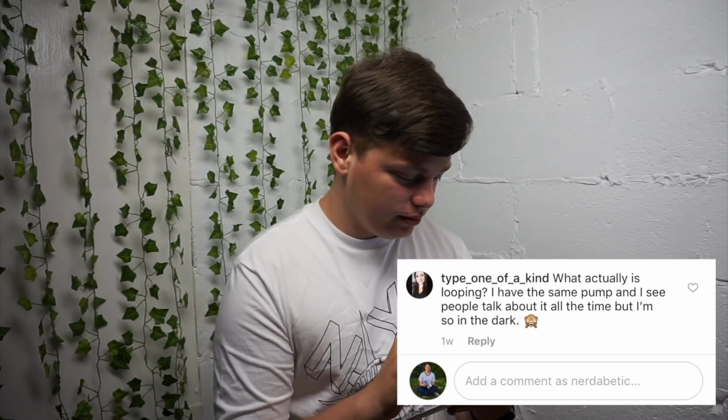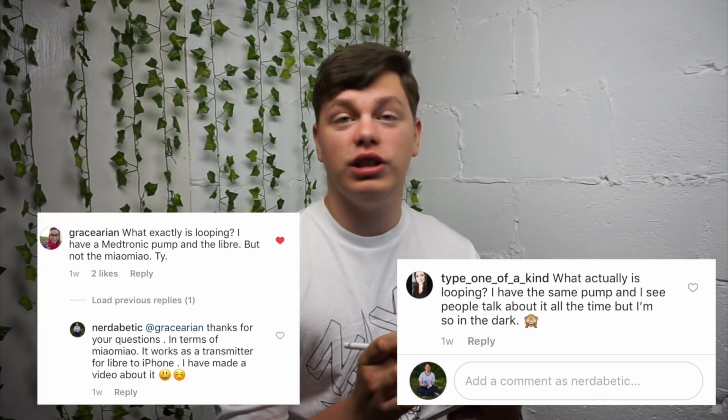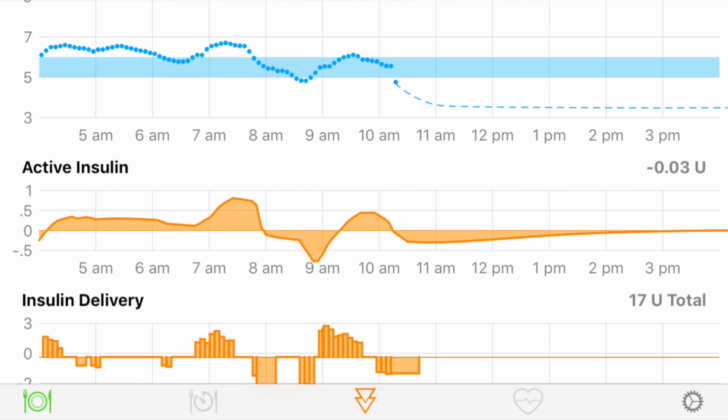So let's go with our basic questions. 2 questions. What actually is looping? I'm going to try to answer every single question in about 20 seconds. Let's go. Looping is an automatic insulin delivery system which adjusts your insulin delivery according to your current blood glucose level, meaning that if your blood glucose level increases, the system will automatically give you more insulin. If it drops, it will give you less insulin.